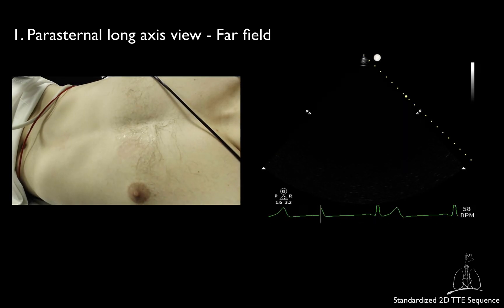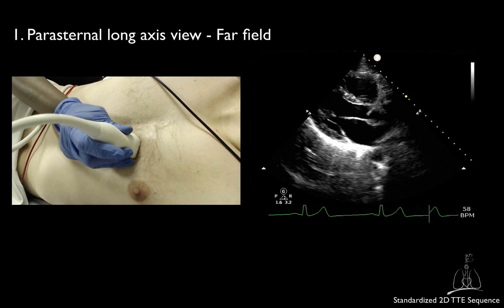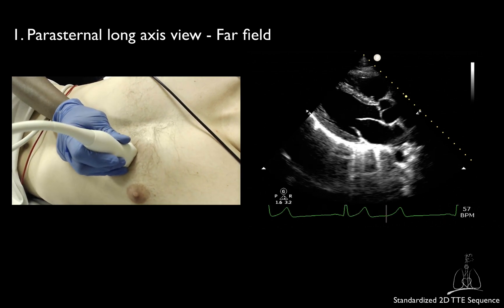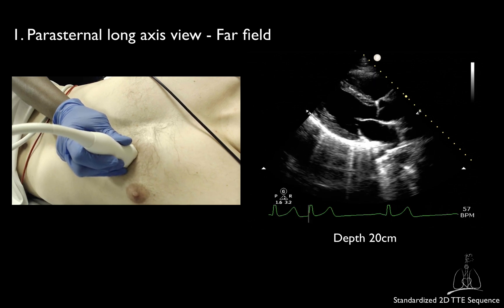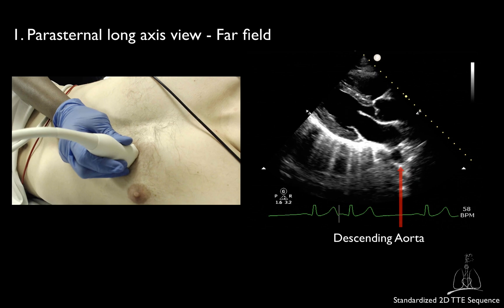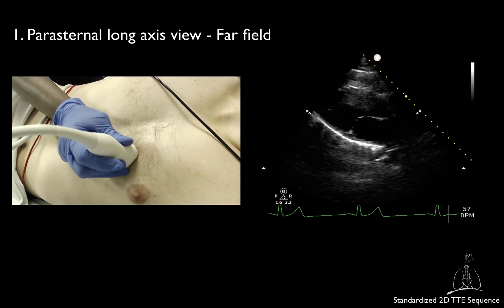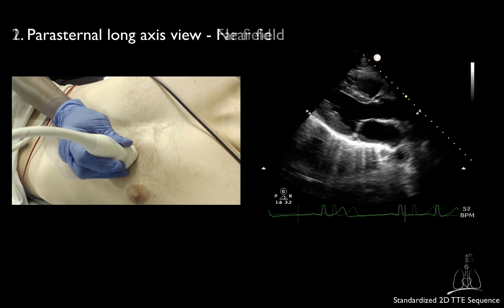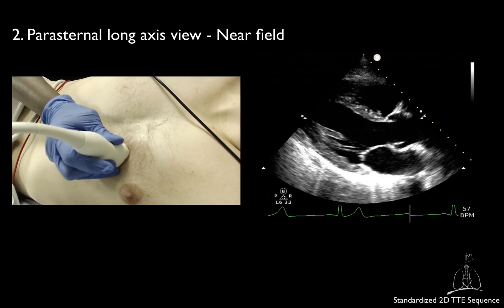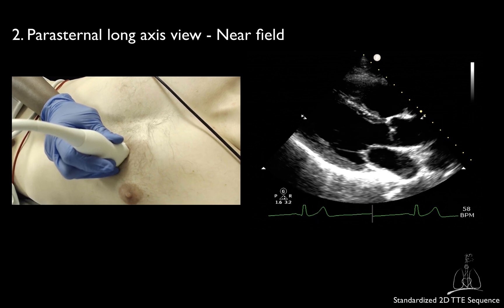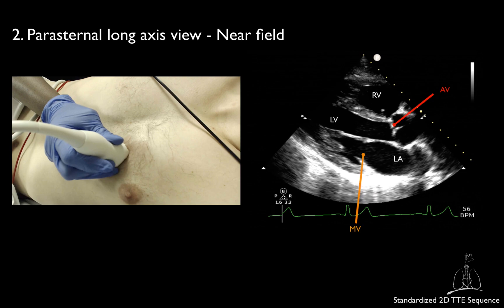Your examination should start with the parasternal long axis view. Begin by including the far field with at least 20 cm of depth. This will enable you to diagnose pleural and/or pericardial effusions and to assess the descending thoracic aorta. Once you have obtained the far field view, decrease the depth to focus on cardiac structures, but try to keep the descending aorta in the field.